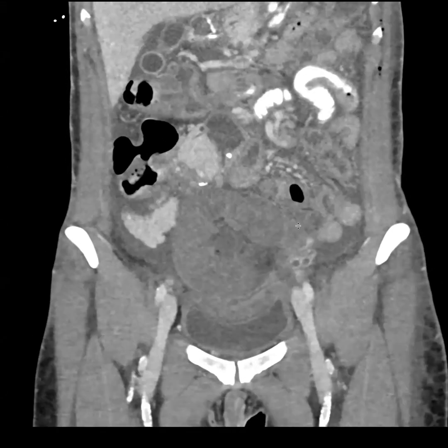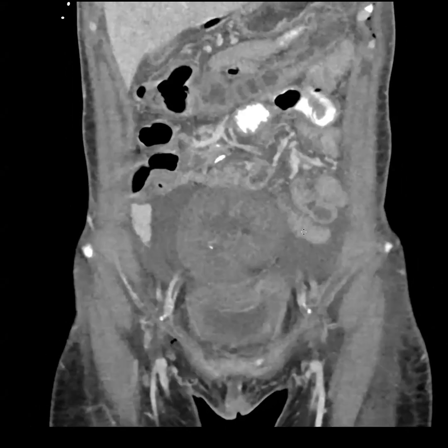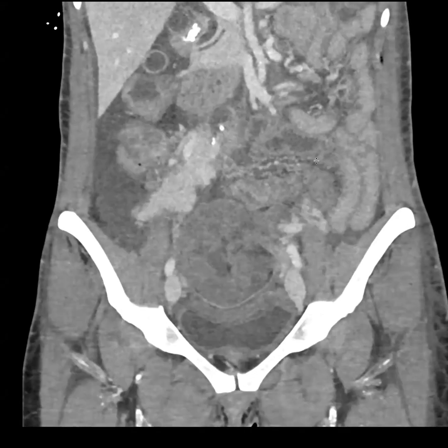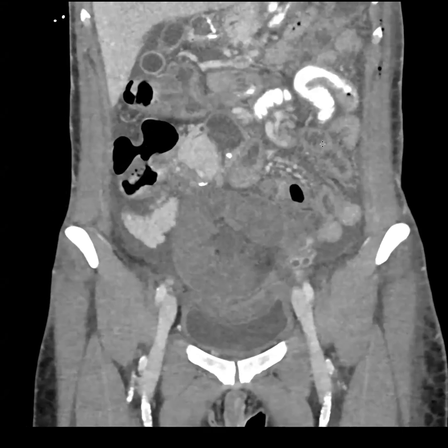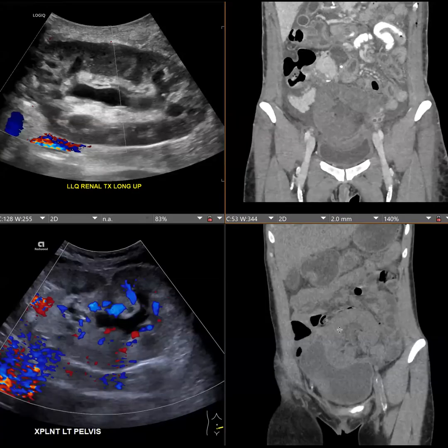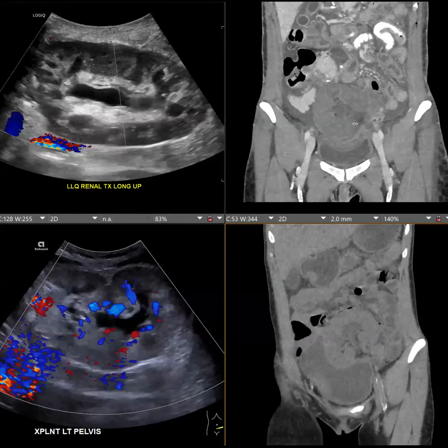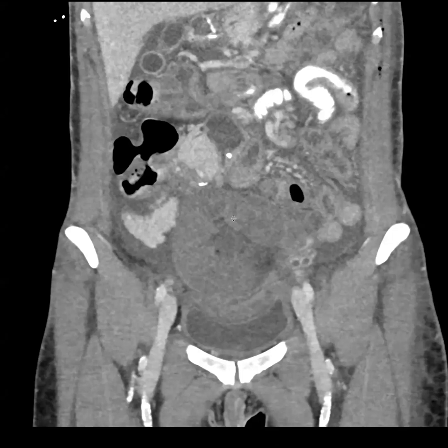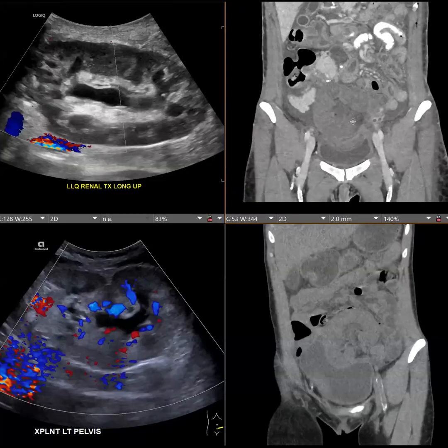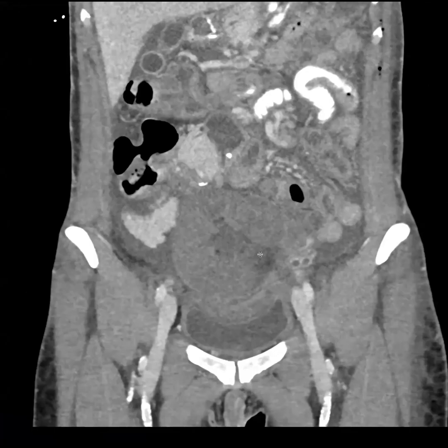So this is a renal transplant torsion. The renal transplant completely torsed on itself, leading to medialization of the transplant and complete absence of flow into the kidney. The patient had surgery, but the transplant could not be salvaged, so they performed a nephrectomy and removed it.